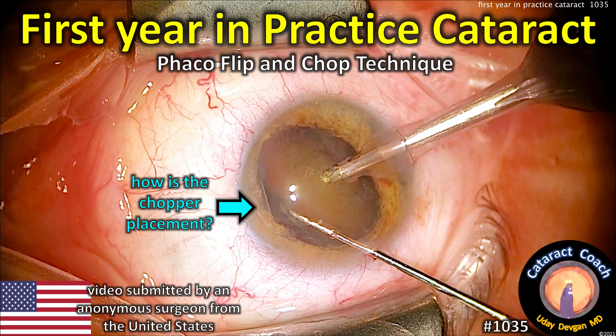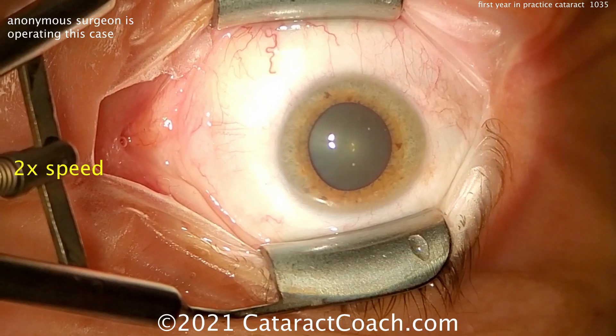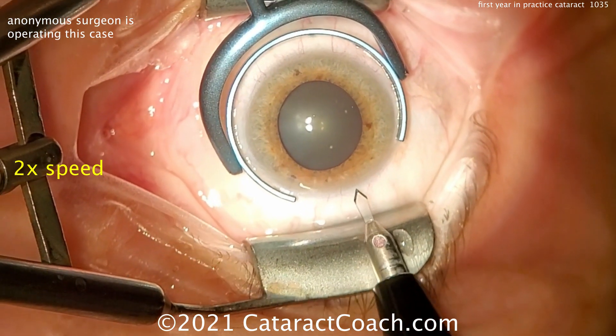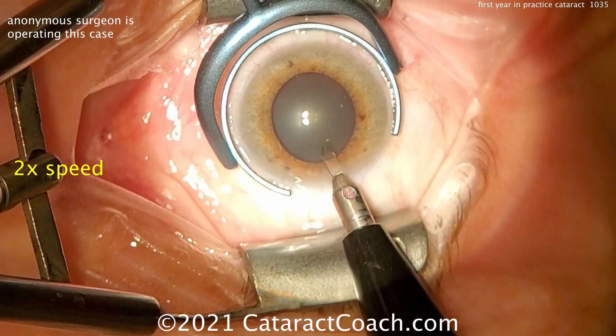CataractCoach.com. First year in practice, cataract surgery, phaco flip and chop technique. We have an anonymous surgeon here in the USA who's showing us a video of a cataract surgery done in the first year of practice.